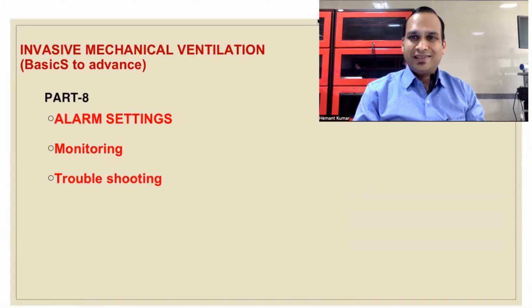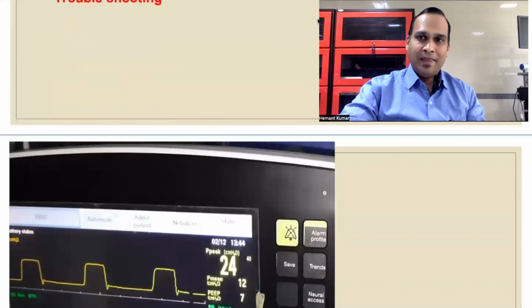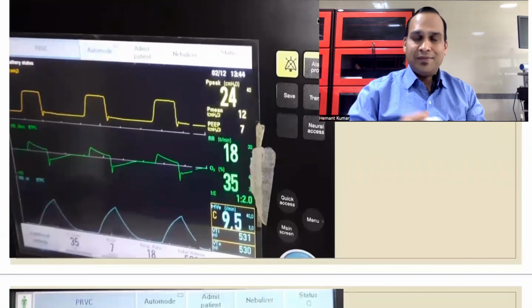Good morning, friends. In this series on Invasive Mechanical Ventilator, we are going to discuss part 8. In this module, we will discuss various alarm settings in the ventilator, how to monitor the patient, and troubleshooting. So first we will discuss alarms.